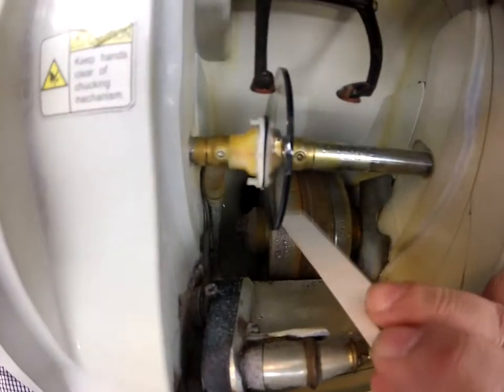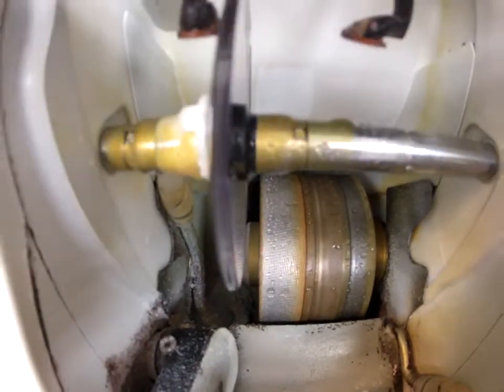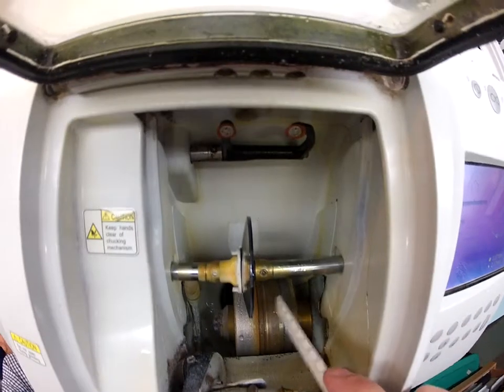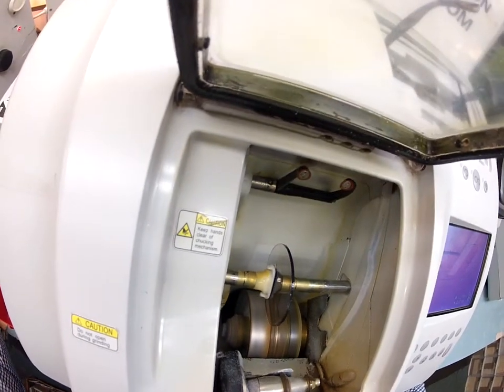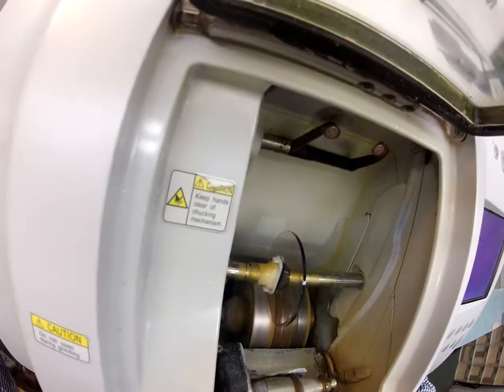The actual cutting wheel is this one over here on the left. It's the lighter color wheel that's like a heavy grit sandpaper. That's going to grind away the polycarbonate material. This wheel in the center that has the little channel in it, that's going to put the bevel onto the lens. I will have to close the door in a moment because it'll get loud, but for now I want you to see your transition lenses as they touch the cutting wheel.